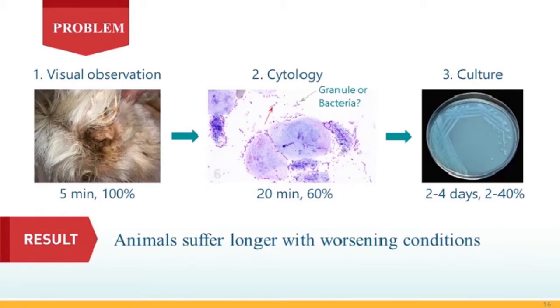And then the gold standard, what should be done each time, is to send out that swab to a laboratory where they would grow bacterial cultures, the same way they've done for 150 years. That takes several days, and costs the pet owner over $100 to get those results. So in practice, that culturing test is almost never done, and you don't really know if you have a bacteria or what bacteria is causing the infection. And so practice goes through a trial and error process.